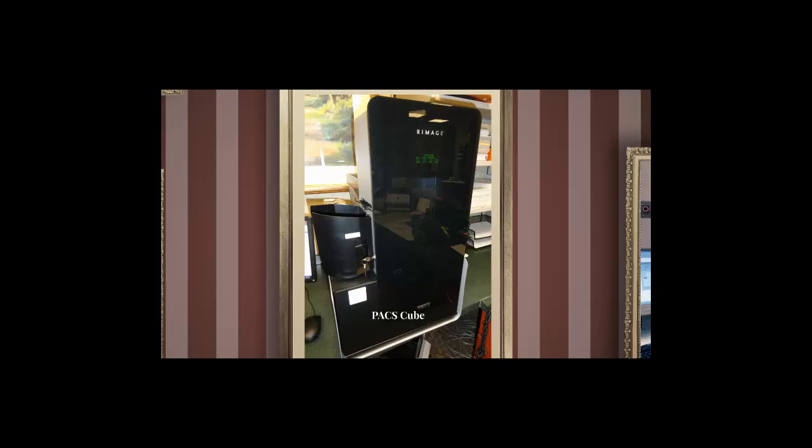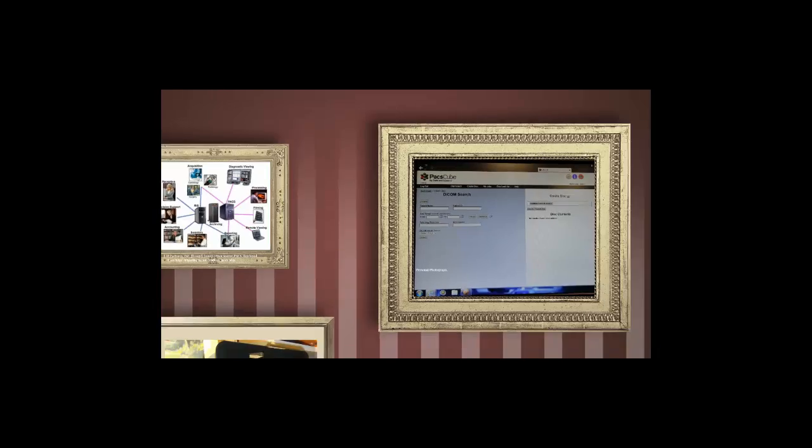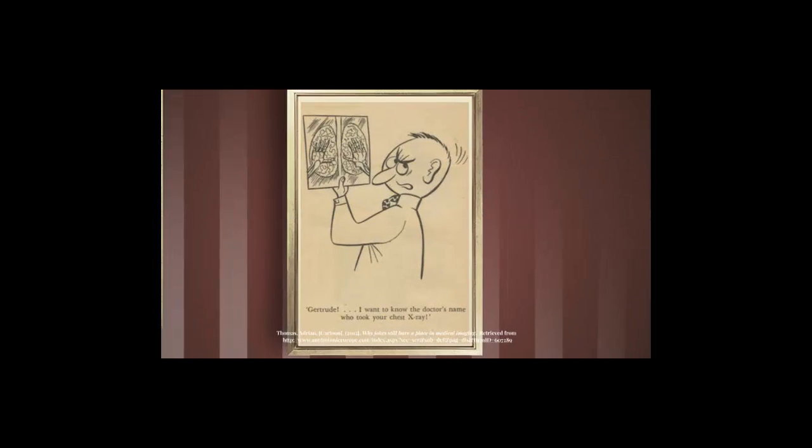Referring doctors are more ready to order these imaging studies because they can see so much more than they ever could before. It's really opened the doors to being able to diagnose more, and not miss things they could possibly have missed in the past. And that goes for mammograms. After 5 years, we do purge our PACS system. So now you have the invention of a whole new field of PACS analysts, who are IT personnel trained to deal with the whole computer system that PACS is and keep it up and running. Because when it crashes, it makes our life pretty hectic.